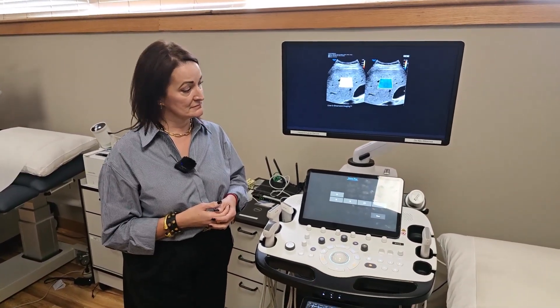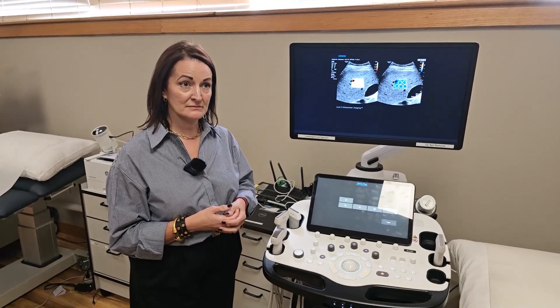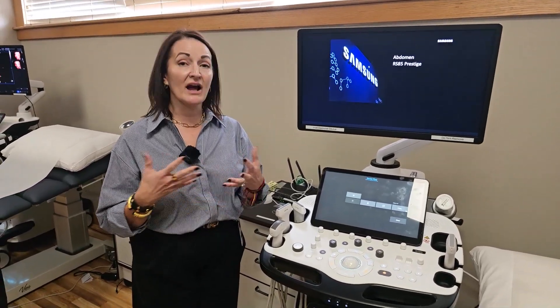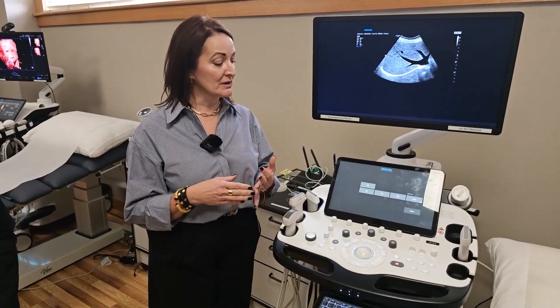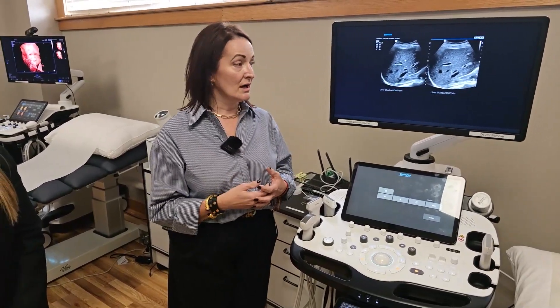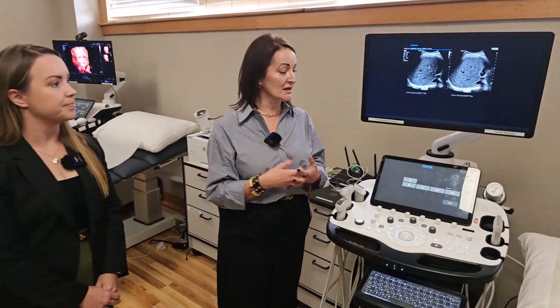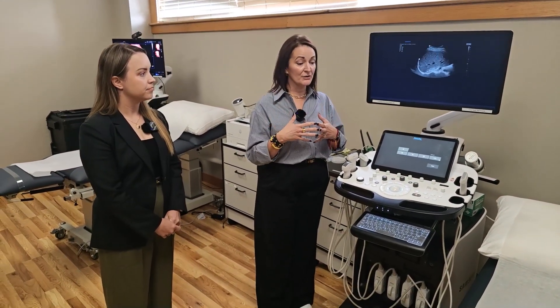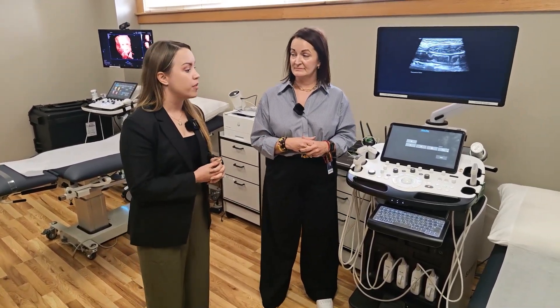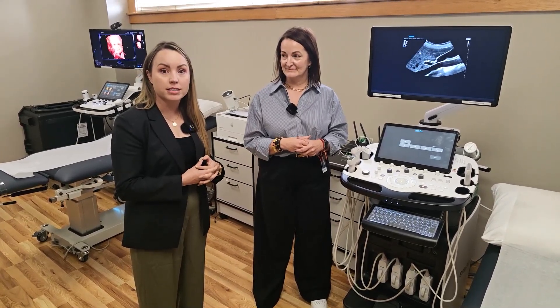This is a general purpose ultrasound. It would be utilized for outpatient, hospital-based ER, radiology facilities, women's health, and vascular labs — whether they're doing a right upper quadrant abdominal ultrasound, scanning kidneys for kidney stones, small parts like thyroid and breast imaging, or vascular exams like carotid or peripheral. In the hospital, you'll also see this in interventional suites where they're doing procedures right in the sterile process.